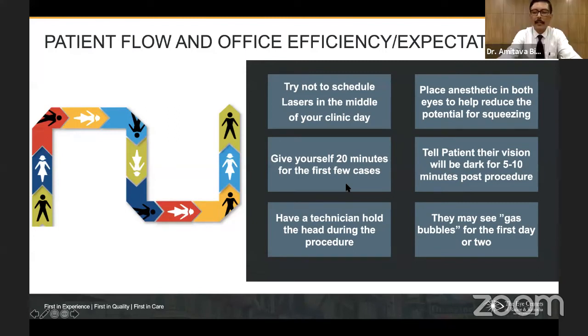That would be a personal thing because it will depend on the business setup or the system under which the center or the clinic is running. Well, what I do, I do not charge in all settings. It depends. If I feel that it's a large enough floater which requires multiple sessions and the patient is mentally acceptable to that, then he's charged. Otherwise, I don't. Okay. There's a great point.